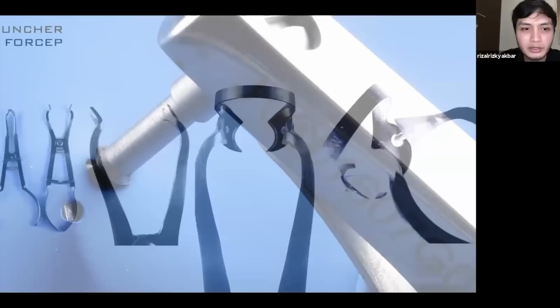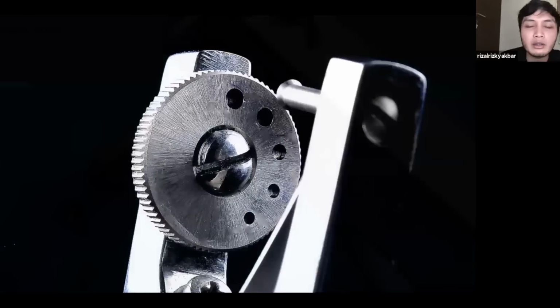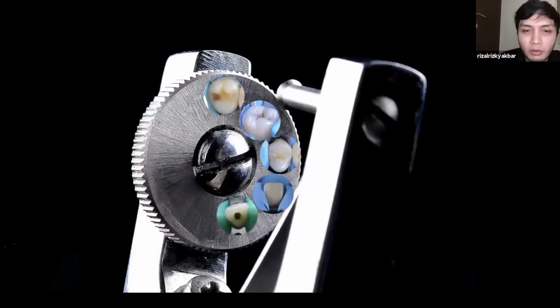And how about the puncher? The puncher comes with the 5 holes. But actually, I only use the biggest one and the smaller one. Smaller one for the anterior, biggest one for the molar or for the anchor clamp, for the tooth that you're going to put the clamp.